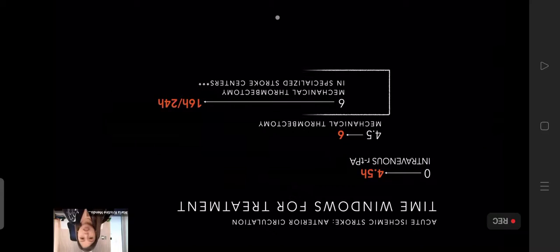So for those presenting in the late time windows, so this would be patients within the 16-hour or 24-hour time windows, assessment of the core or collaterals is included in determining the eligibility of patients for thrombectomy.